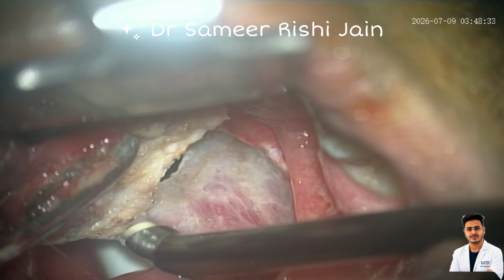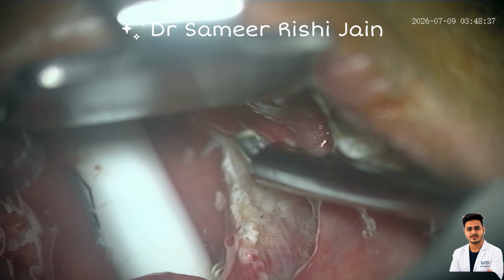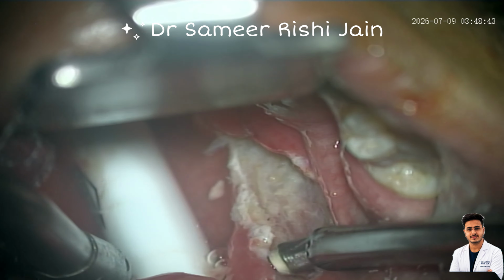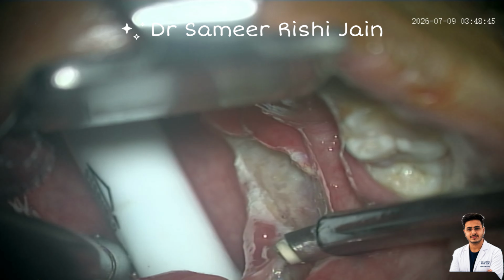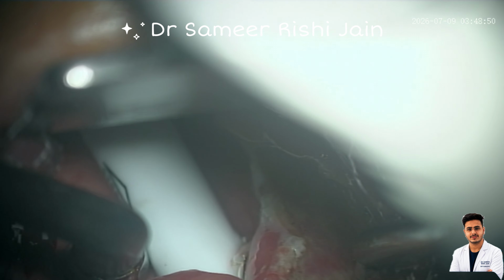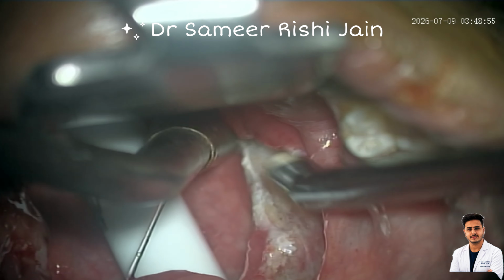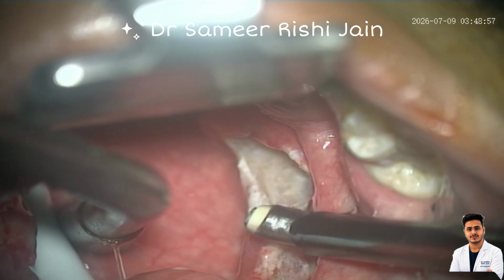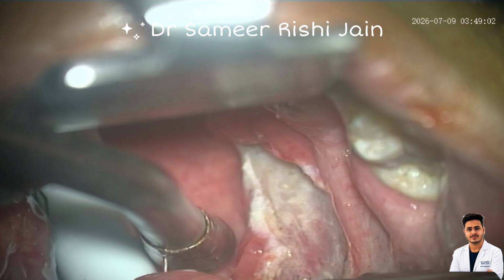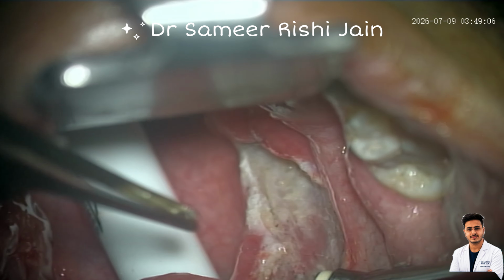You can see the tonsillectomy on the right side is complete and there was minimal bleeding, and in almost 60-70% of the tonsillar bed the fascia is not exposed. As this was an extracapsular tonsillectomy, the opening up of the fascia was inadvertent, but we can minimize this in the procedure. A little bit of the tonsillar bed muscle fiber can be exposed, which can lead to a little bit of pain in the post-operative period, which can be managed with the help of analgesics.